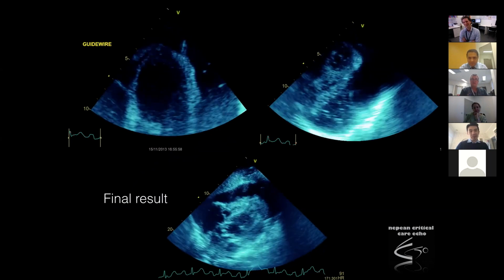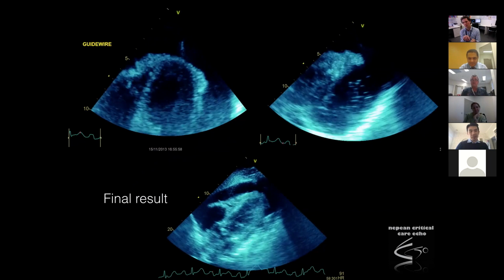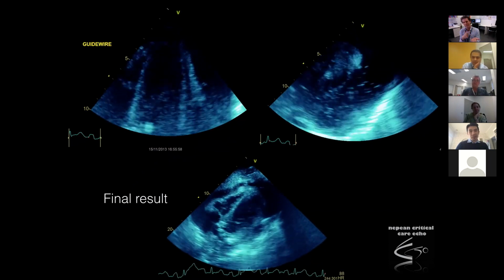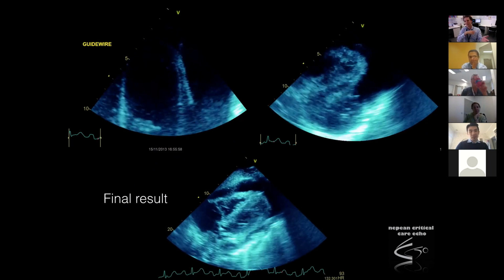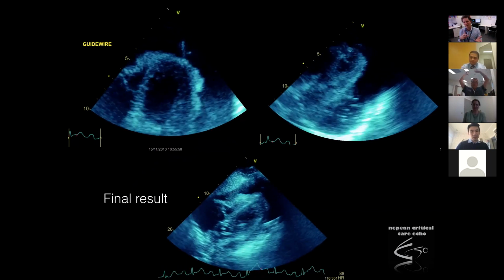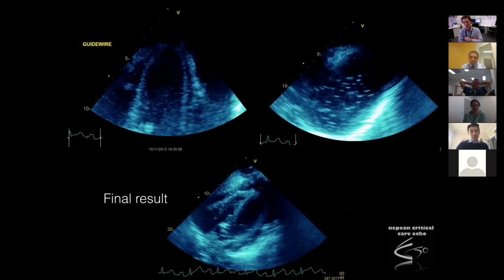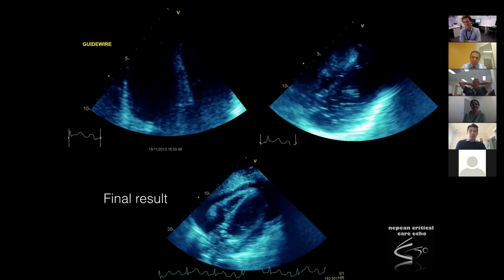One of the things that I used to do is, after you think you're in the right space, try to agitate some saline and squirt it in. I've sprayed myself, the patient, and other members of staff with water a good few times. I've tried to inject the agitated saline through a weird system that had a filter on, so the bubbles got destroyed. I messed around a lot, and I did that with David. He's never let me forget it.